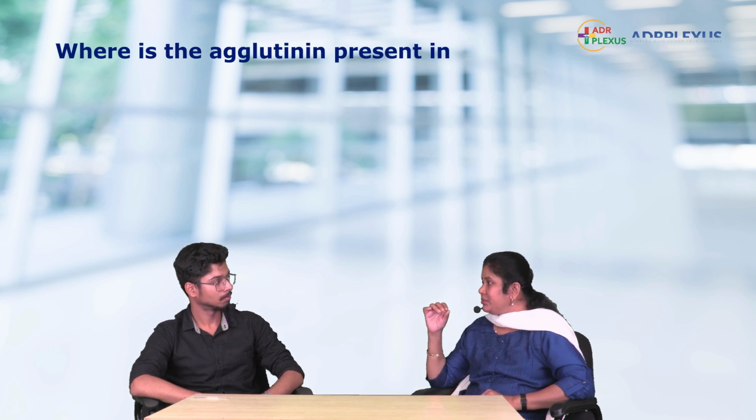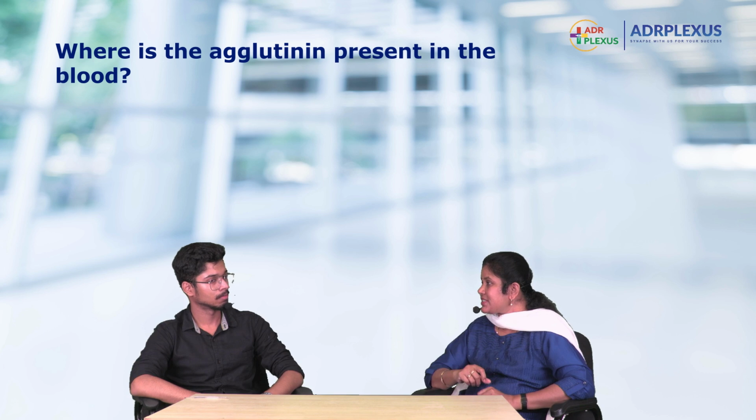In the surface antigen, ma'am. Okay. Where in the blood is agglutinin present? The plasma, dissolved in the plasma. Yes, ma'am. Okay. For the RH typing, it's based on the agglutination reaction, where the D antigen reacts with the anti-D antibody, ma'am. Okay. So that's the principle. Yes, ma'am. Okay. What is Landsteiner's law?